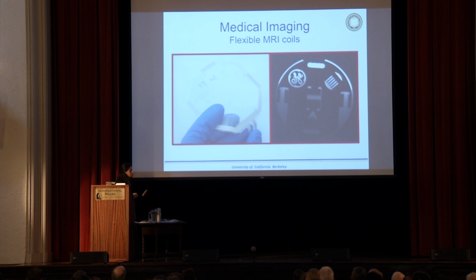So when I joined the department, we started talking, and he told me the biggest problem we have with MRI is that the hardware that we use for the imaging doesn't fit the body. Do you think you could do this with flexible electronics? I said, maybe. So we talked a lot, and we came up with a plan.